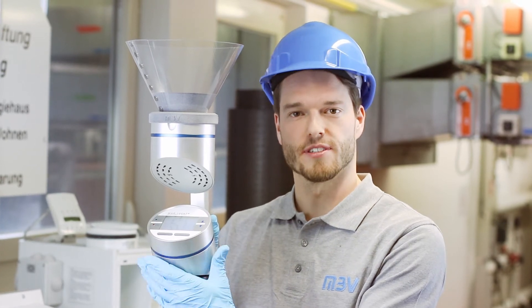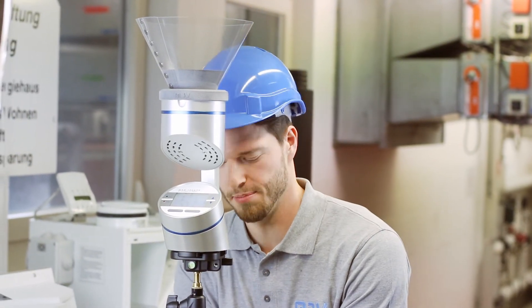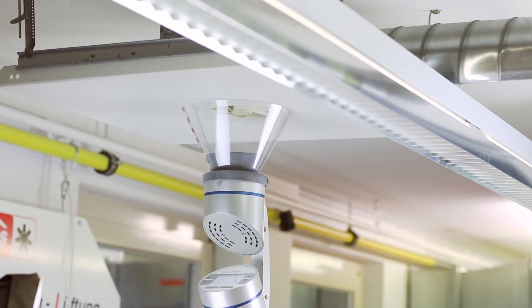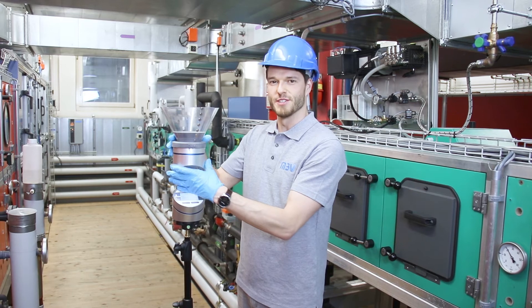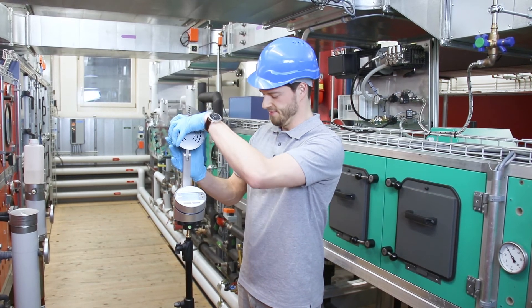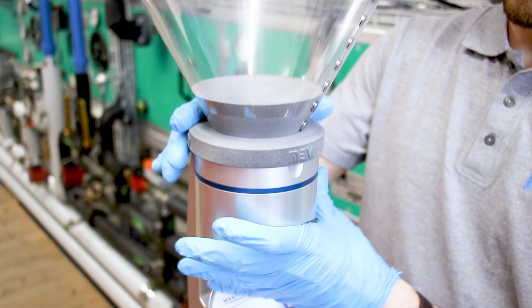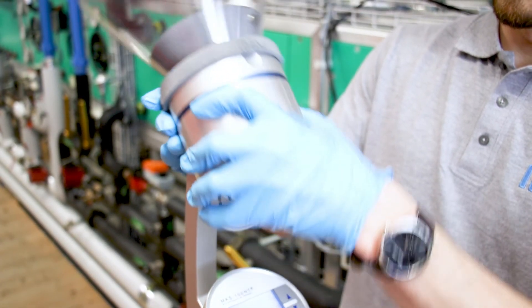Now I use the tripod to lift the air sampler up to the air outlet. But what if the ceiling outlet is on the side? I simply turn the measuring head by 90 degrees and repeat the procedure as before. It's as simple as doing it this way.